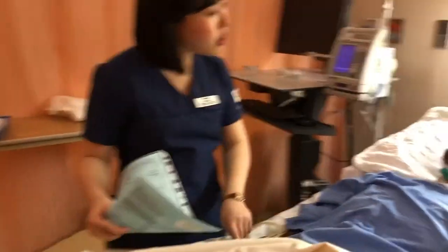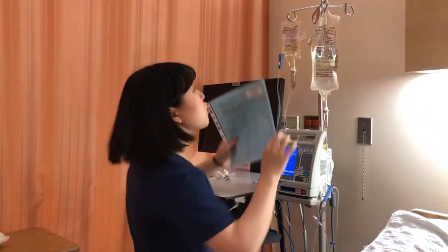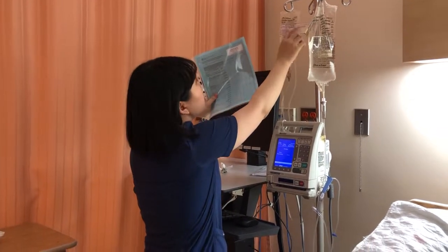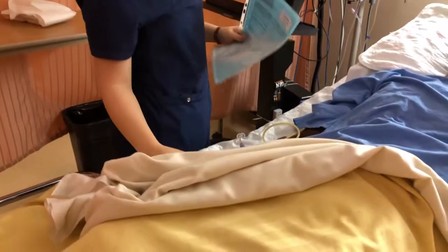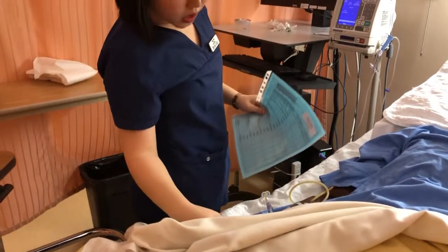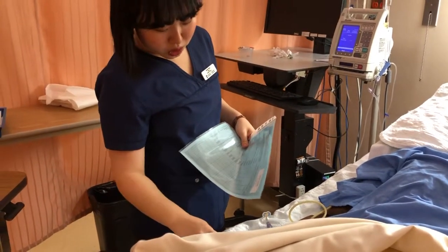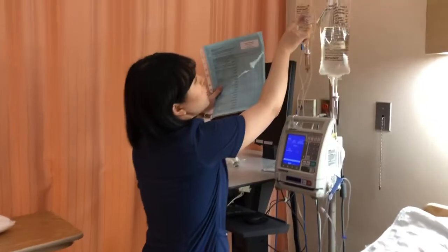Do you have any pain here? No, it looks good. And I'm also doing my second medication check with the bag and label here. So it's the right patient. I'm going to check the patient's armband first. So can you verbalize your full name? Okay, and your date of birth. Okay, and I'm also checking the name here, and the FIN number is right. So I checked the right patient.